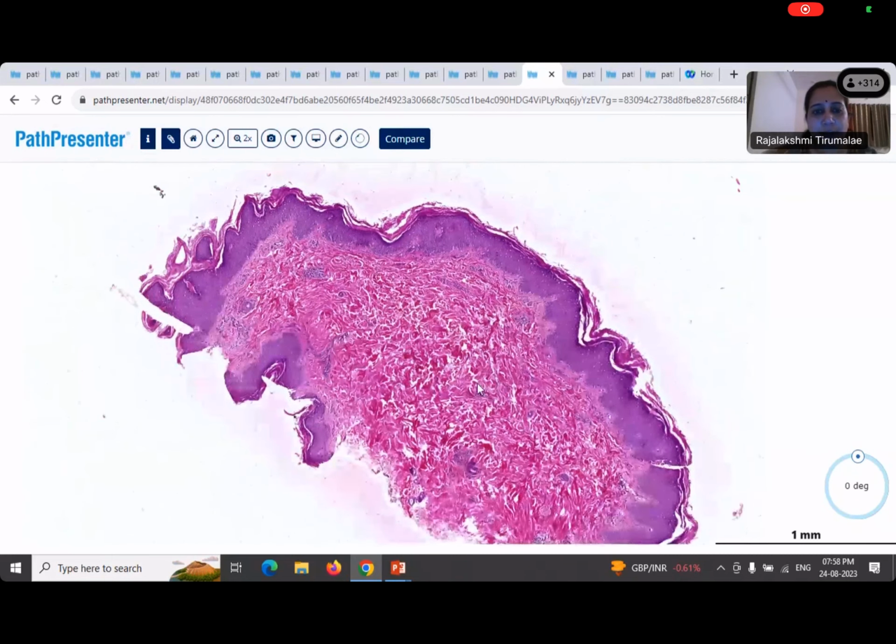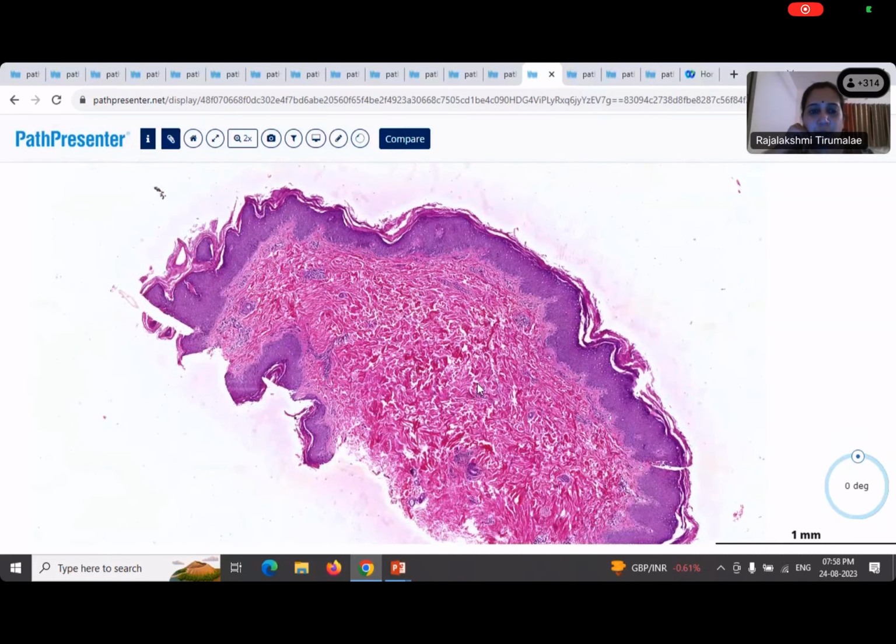Yeah, ma'am. So is there any pattern of infiltrate that you're seeing in the dermis? Yes, ma'am. Okay, what is it? I think it's like the hyphae, is it either an artifact or a proper mycosis? Okay, we'll go to that. But right now, at this magnification, what are you seeing? There's a reason that I've given you this. Yes, ma'am.